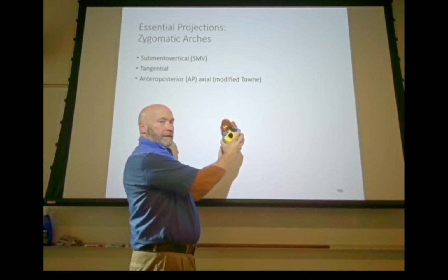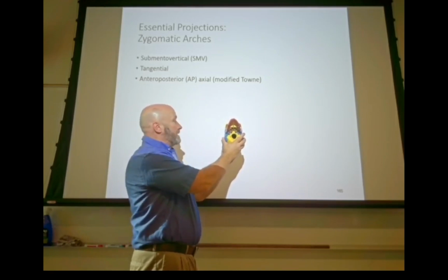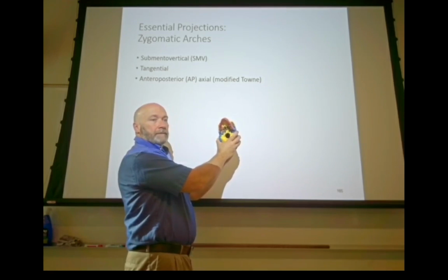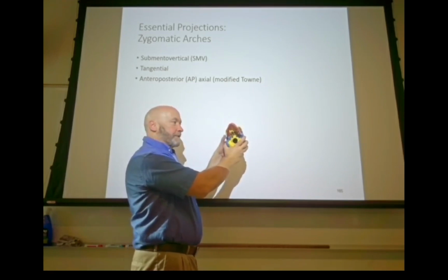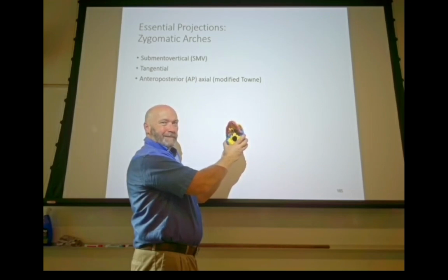So what is rotating of the skull doing? Really not much. If you forget one of those two things, don't forget the tilt of the head. But what the book is saying is rotate and then tilt. So it's not really a contradiction. It's rotate towards the side of interest and then tilt the top of the head away from the side of interest. Okay, you see that?